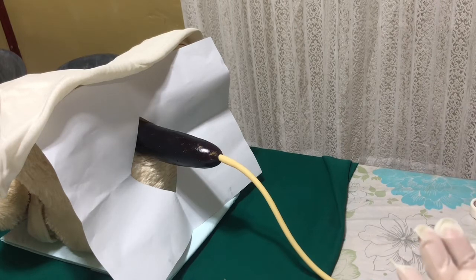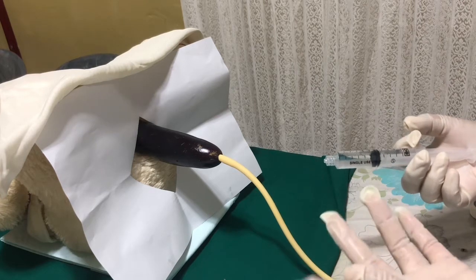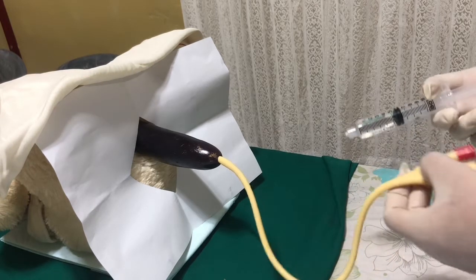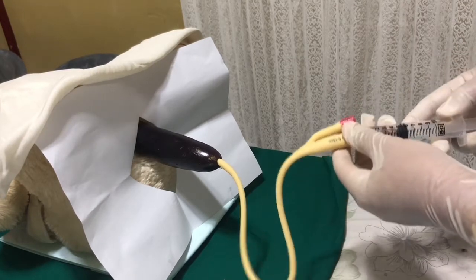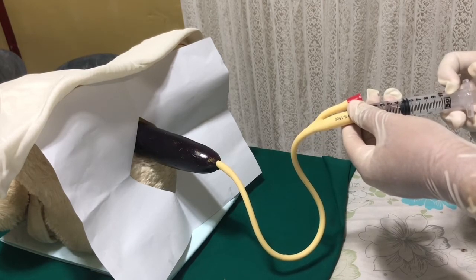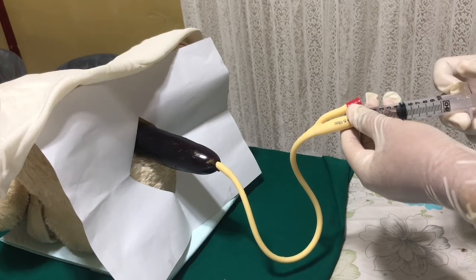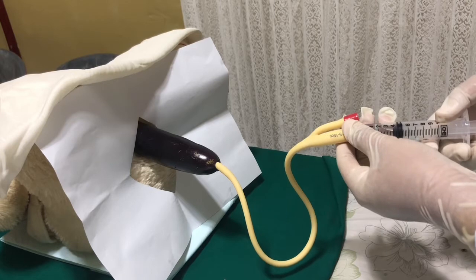If a Foley catheter is used, introduce 5 cc or follow the manufacturer's instructions to secure the catheter. Gently pull the catheter until the retention balloon is snuggled against the bladder neck. Resistance will be met. Attach the catheter to the urine bag.